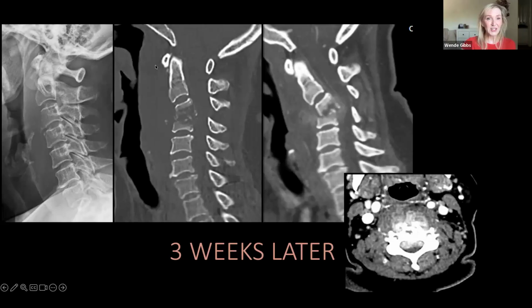So in that 3 weeks, she's already at this level at 3-4, got collapse of vertebral bodies. She's got a new kyphosis. She's got a kind of retropulsion of this body into the canal, producing significant narrowing, probably even thicker prevertebral soft tissues. She's got that demineralization, the osteoclast-activated resorption from the inflammation from the infection.